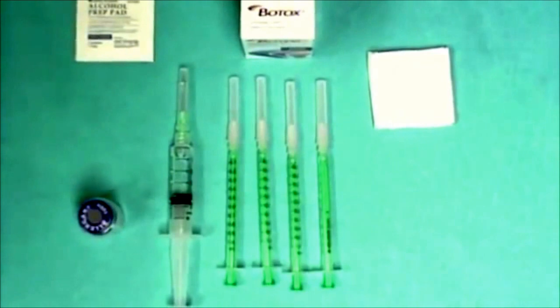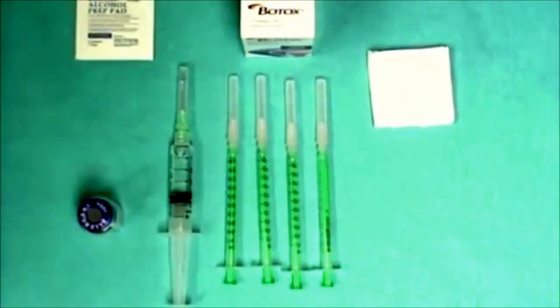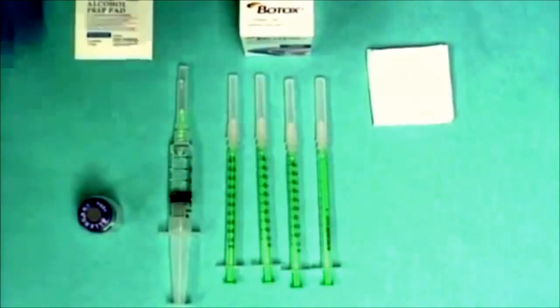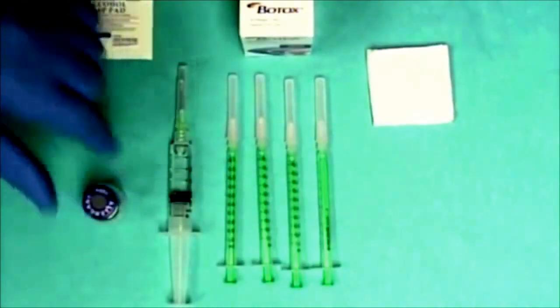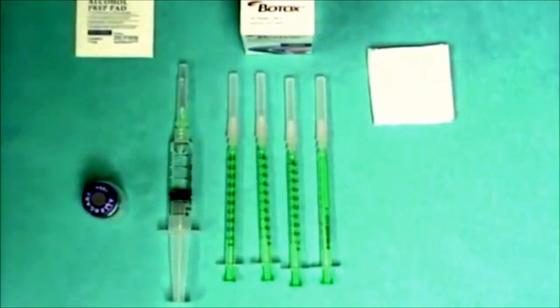Remove the toxin from refrigeration and uncap. This is a 100 unit vial of Botox and we are doing the standard 2.5 cc reconstitution with saline solution.